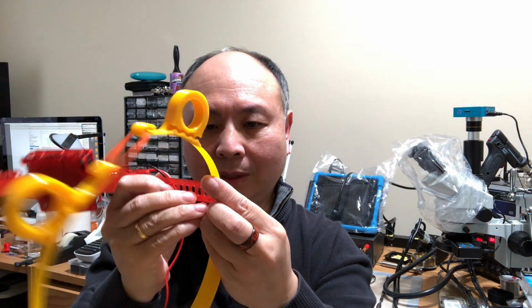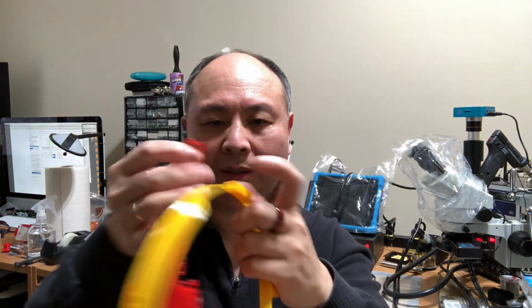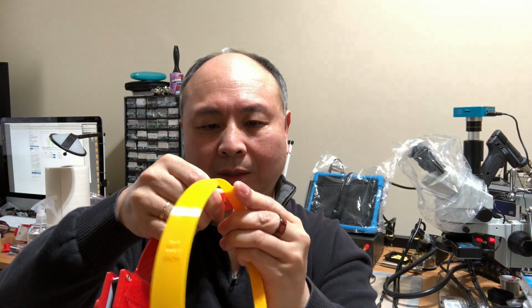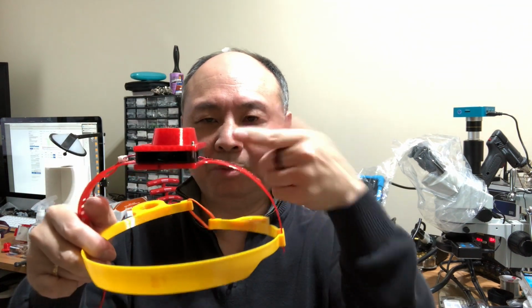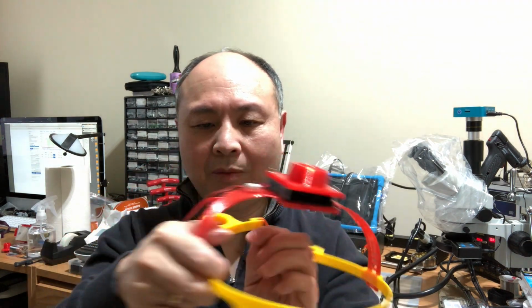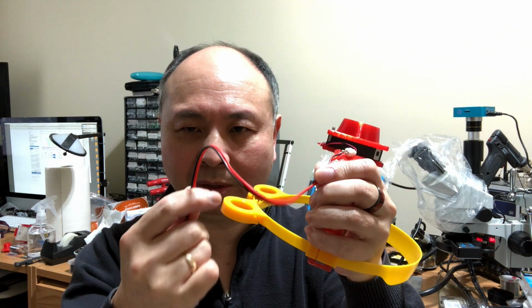So let's go ahead and put the unit on the Halo loop. I'm going to just go ahead and click it in. There, on that side. We'll click in on the other side. Of course, the fan is blowing forward, and we still have to secure the heavier portion of the cord.